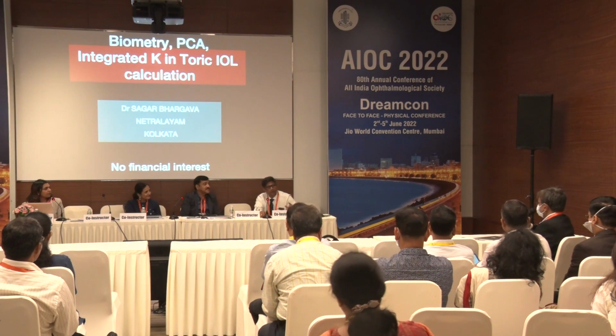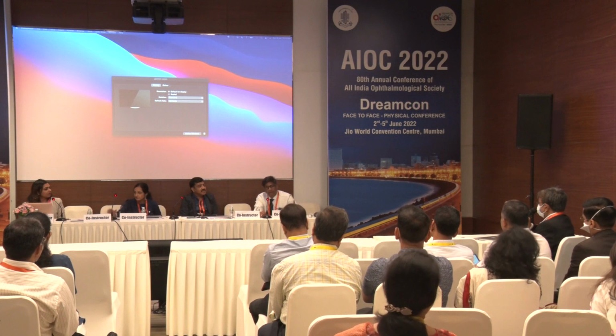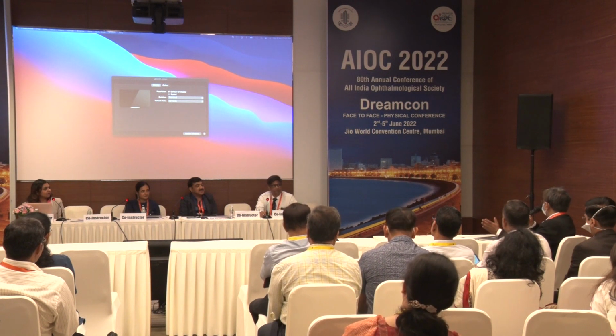I have a quick question for Arup and Ajay, who are experts in this field. There is a group of patients who have against-the-rule astigmatism, say about 1 or 1.25 diopters, and they are not wearing glasses. Basically, they are using the toricity to do the reading. Would you implant a toric IOL in those patients? No, the other eye is very important.